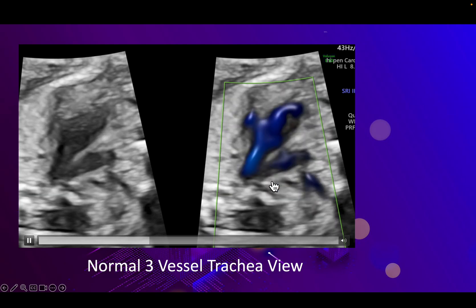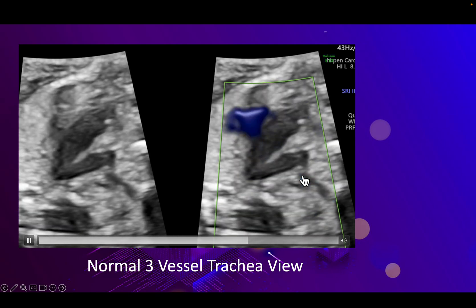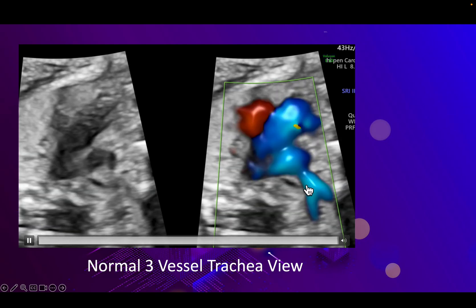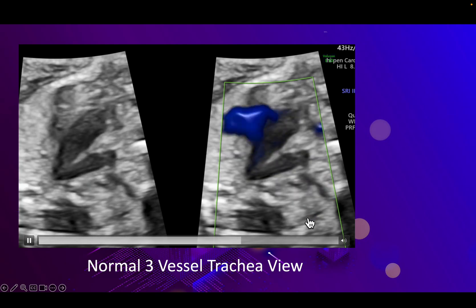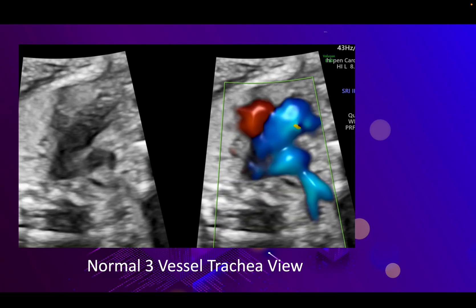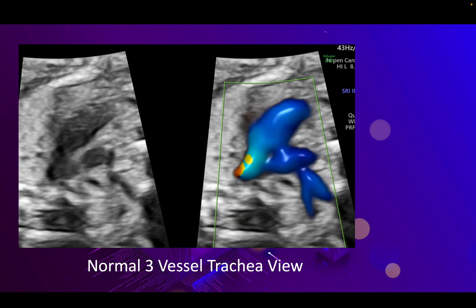The left subclavian artery is also visible, and you can actually see it branching into the vertebral artery and the subclavian artery.